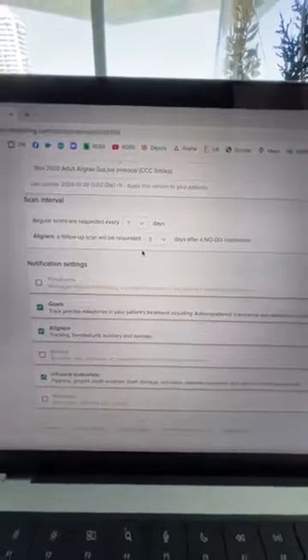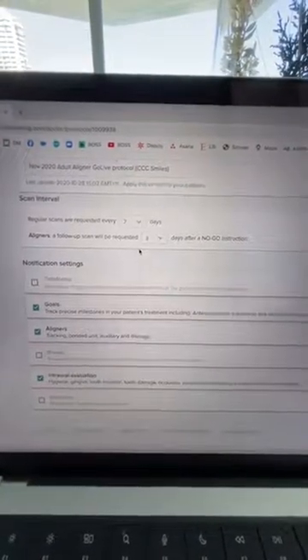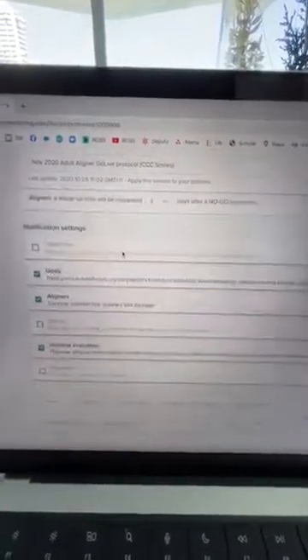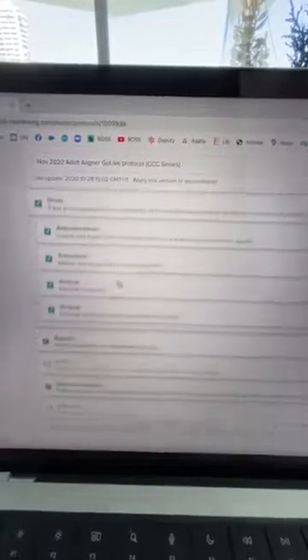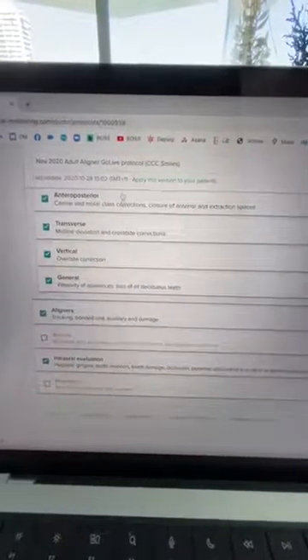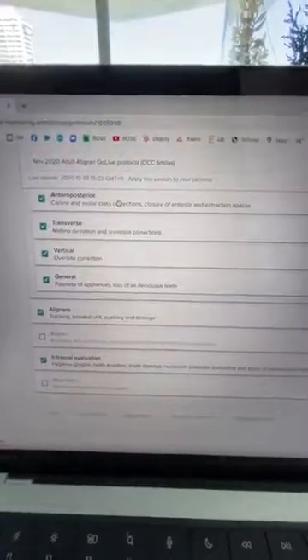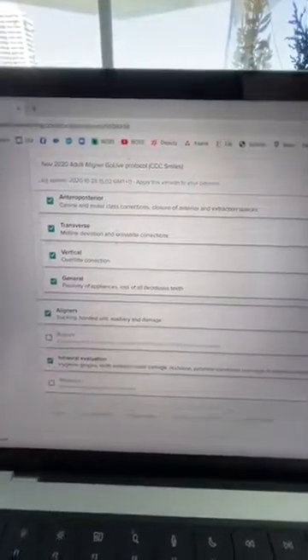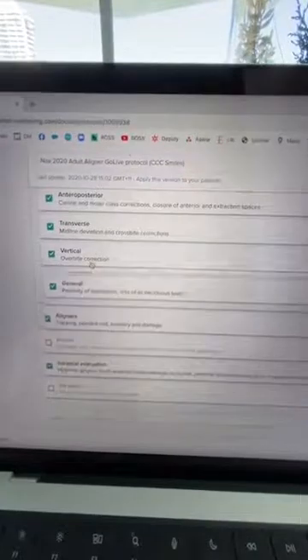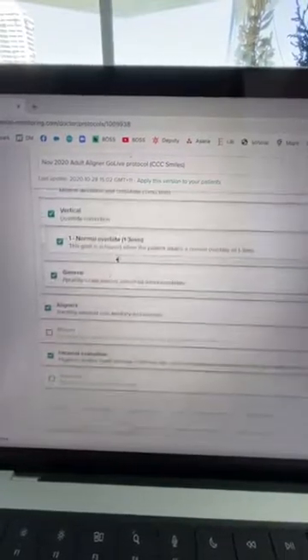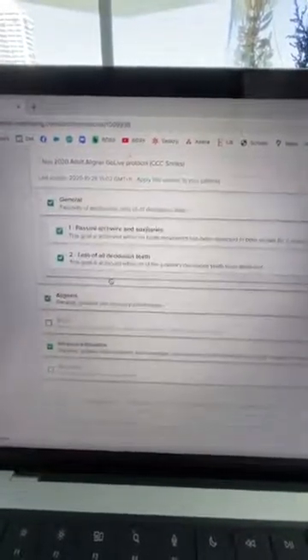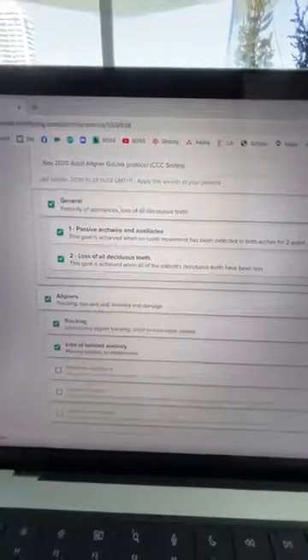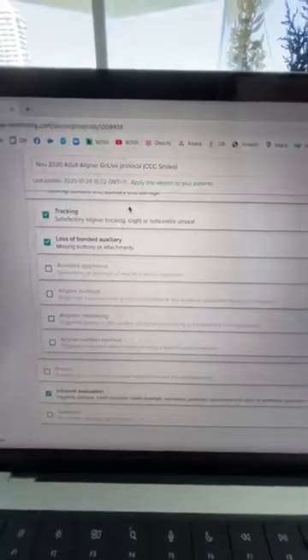If the patient gets a go, scan them every seven days. If they get a no-go because the aligners aren't fitting well, do that. Now there's a lot of notifications you can get. For example, I can track all my goals: alert me when the canines become Class I, alert me when crossbite's corrected, alert me when overbite's corrected.